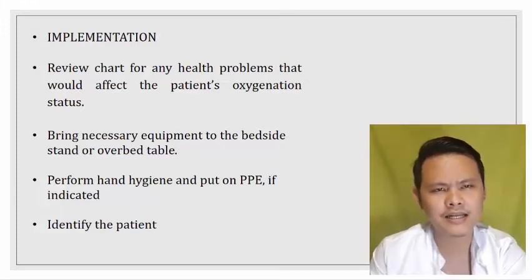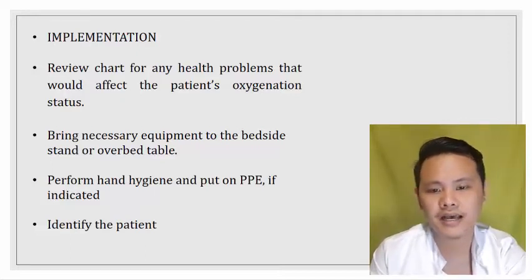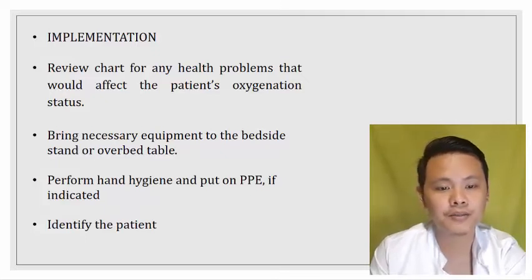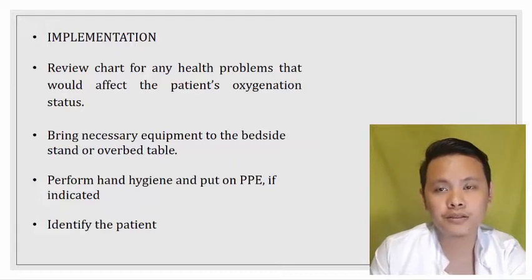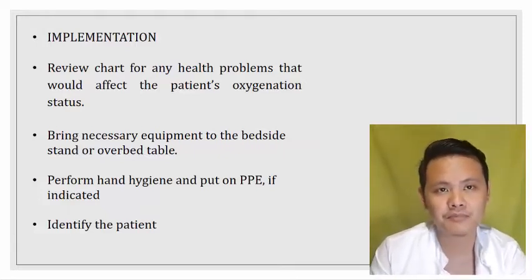Okay, kailangan i-assess natin ang pasyente natin. What else? Bring necessary equipment to the bedside stand or overbed table. Kaya na sa ganun, mas accessible sa atin ang procedure na gagawin natin. Perform hand hygiene and put on the PPE if indicated. Always remember, if you will only required to do it, then do it. Pero kung hindi naman kailangan, if it is not really necessary, then you do not have to wear gloves or any other PPE because nakaka-offend yun sa part ng pasyente.